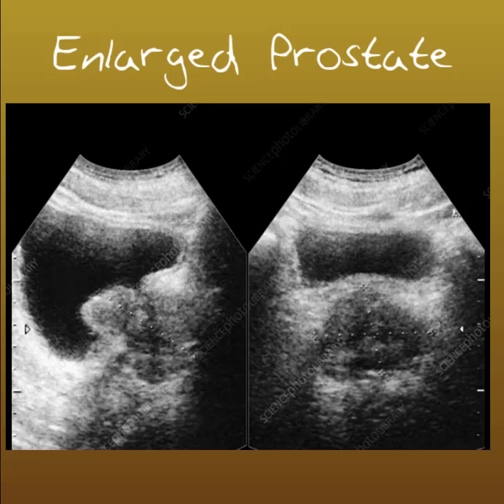So just speaking of some of those things that cause issues, we talked about the urethral stricture, and one of the ways that the urethra commonly gets shut down is because of an enlarged prostate. So here is the bladder in transverse, and we have this large prostate underneath it. This is the bladder in long, again with a large prostate inferior to it.